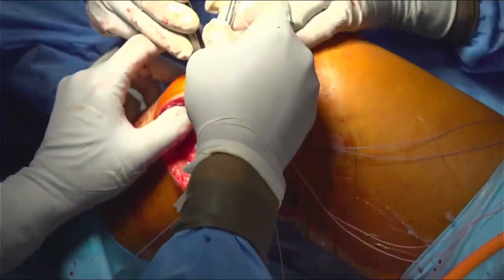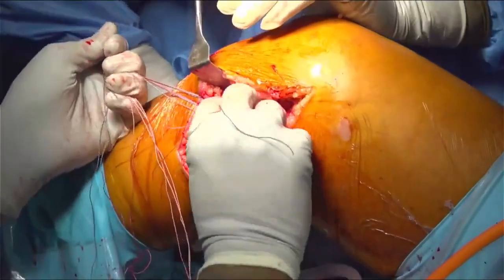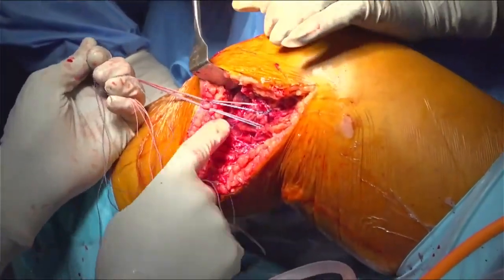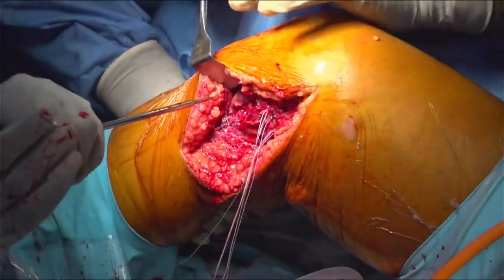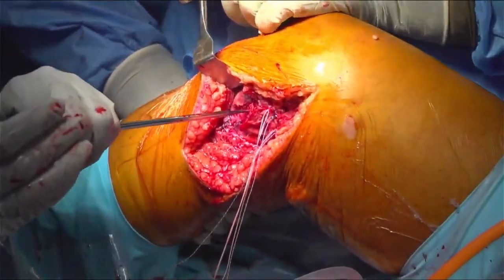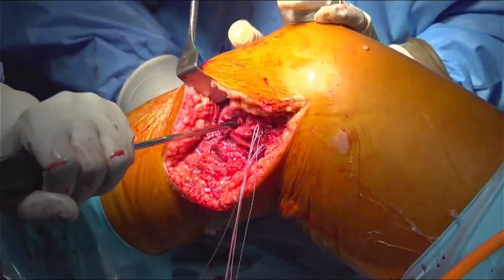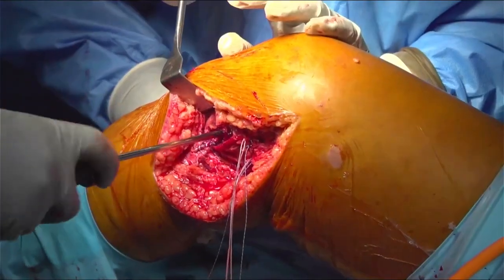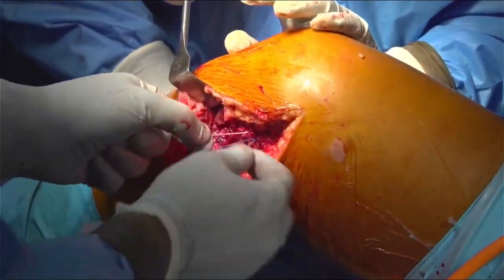Now I'll put, leave it. Now I'll put my this here, and I like to repair this into a lateral row fashion here. Okay, so I'll put a lateral row anchor here. Anchor hammer, please. So this is my LR anchor, and I'll put 4 of these.